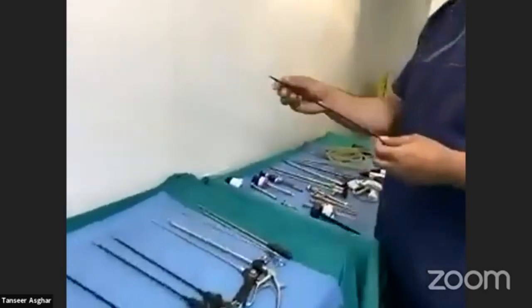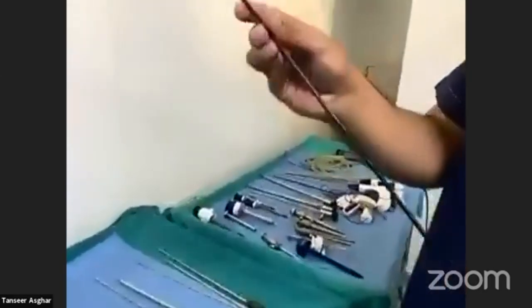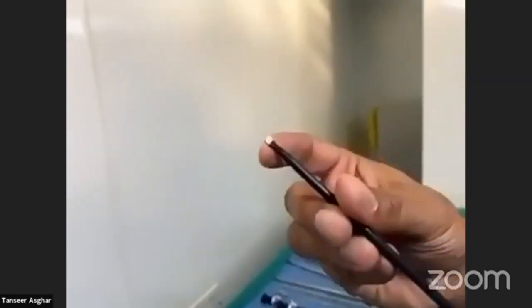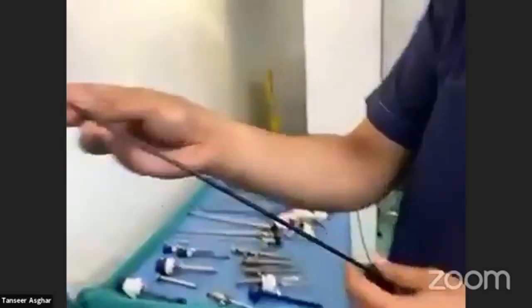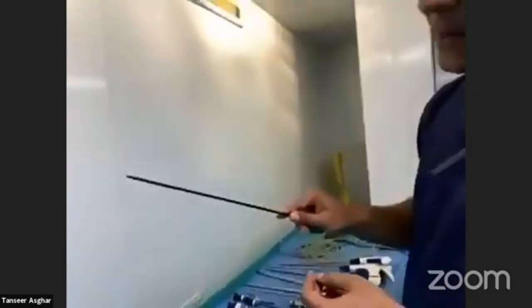This is another instrument similar to the L-hook, but it is called a spatula. It has a flat end and you can attach it to the cautery. It is used on the liver bed or in areas where you want to apply cautery with a blunt hand.